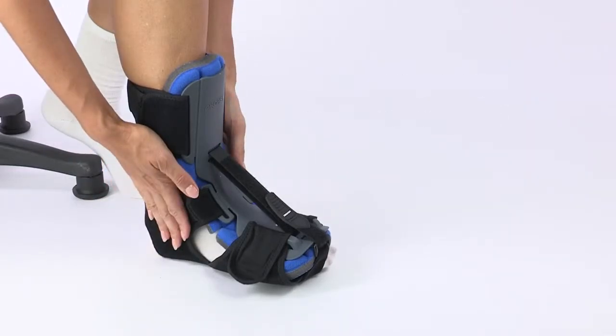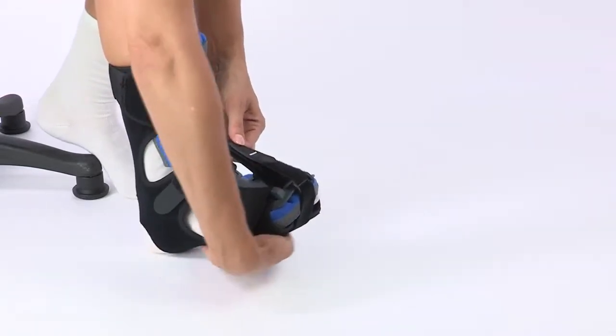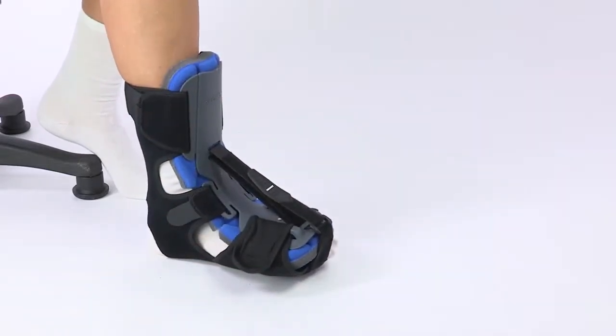For an additional stretch on the plantar fascia, you can pull up on the dorsiflexion strap until you have achieved your desired amount of stretch. If you like, you can use the toe strap to create a more snug fit, wedging your toes comfortably into the splint.